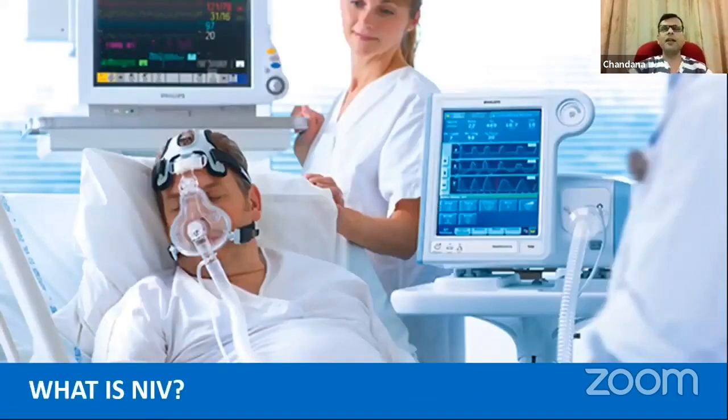Now, non-invasive ventilation, I hope all of you have seen what it looks like. We basically use a face mask with a good seal to the facial contours, and we use that with certain devices to give some support to the patient's breathing in the way of pressure support.